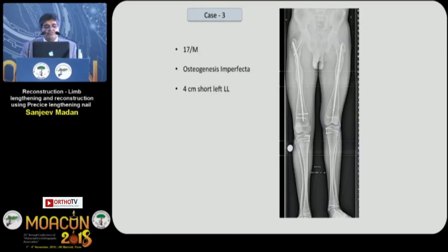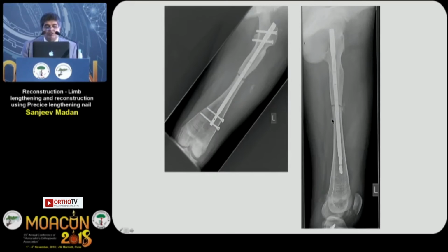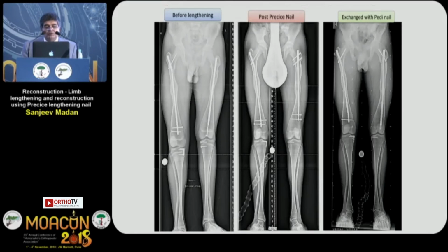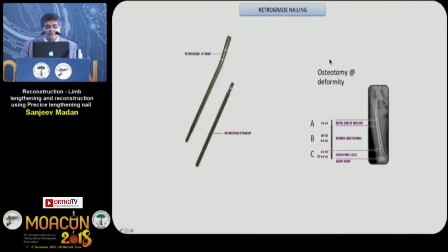So this is a case of osteogenesis imperfecta, 4 centimeters short. The patient had a Sheffield rod here. We have a rod which is a telescoping rod because this rod actually lengthens with the growth of the bone. But the patient was short, and so then we removed it and changed it to a Precice nail. And then after the lengthening and consolidation. So before lengthening, post Precice lengthening, you can see the axis correction.